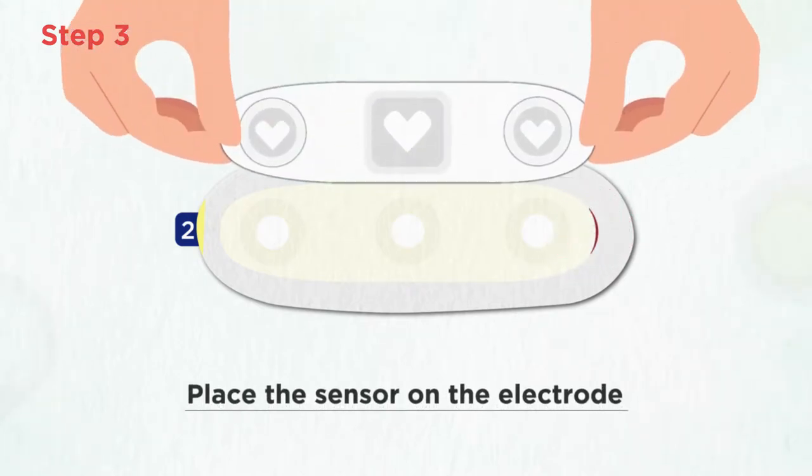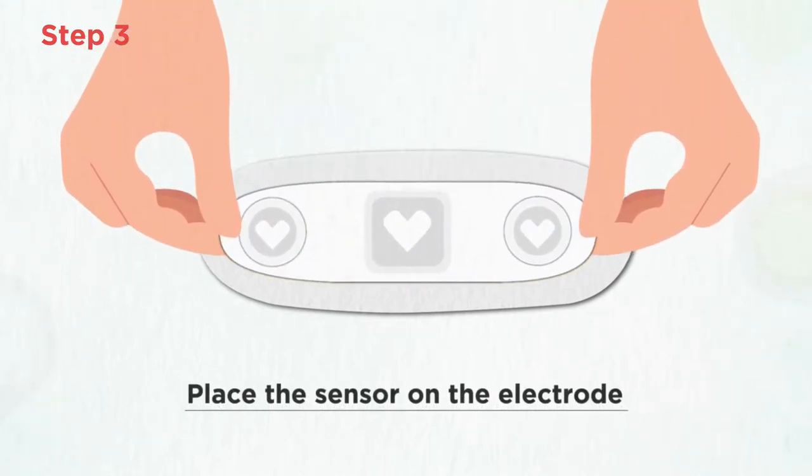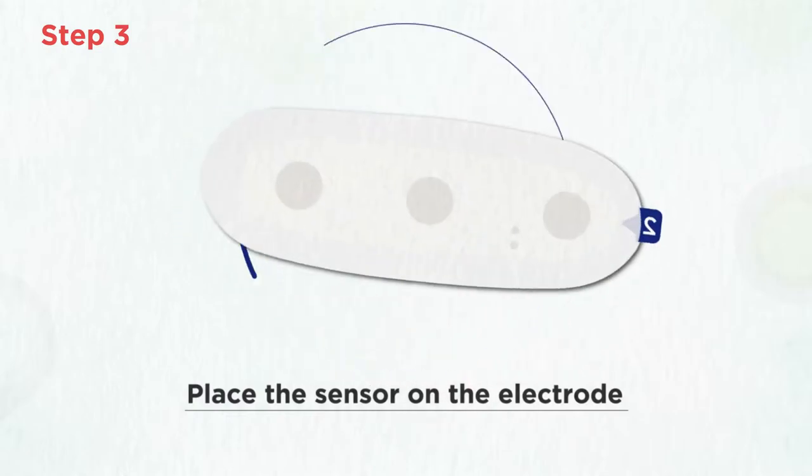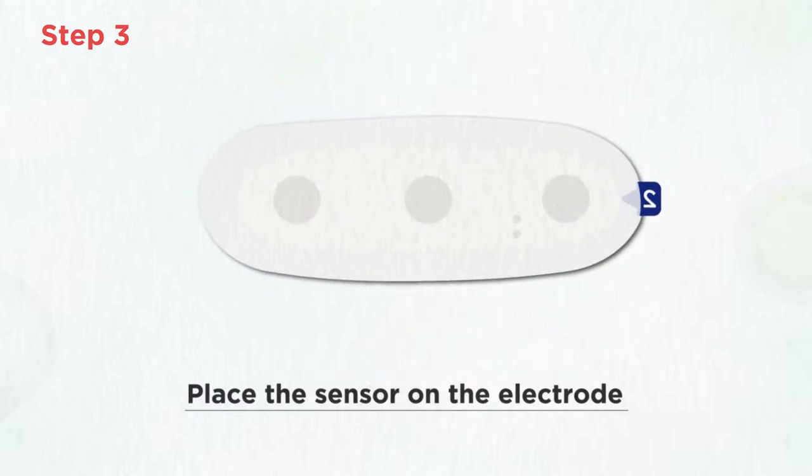It is easiest to turn the sensor upside down on a flat surface and look through the adhesive to line up the three circles.